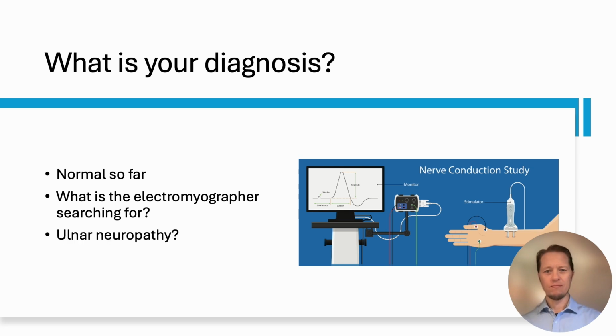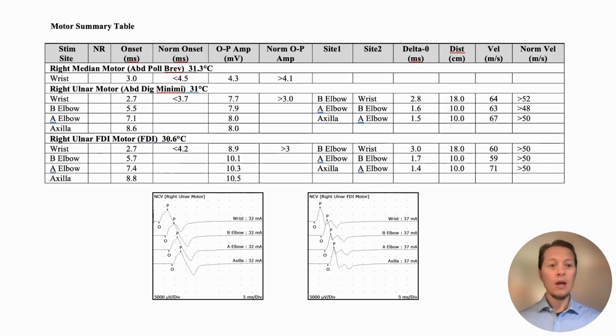Based on the studies that we're doing, either an ulnar neuropathy, or someone might say, well, maybe it's a lower trunk or inferior trunk brachial plexopathy. Got it. Fair enough. Let's get some motors. And with motor, median and ulnar here, no significant amplitude drop in ulnar when we go proximally, no significant segmental conduction drop at the elbow either. Pretty good waveforms here. But clearly, did it at ADM, also did it at FDI. Someone's sniffing out an ulnar neuropathy, it seems.